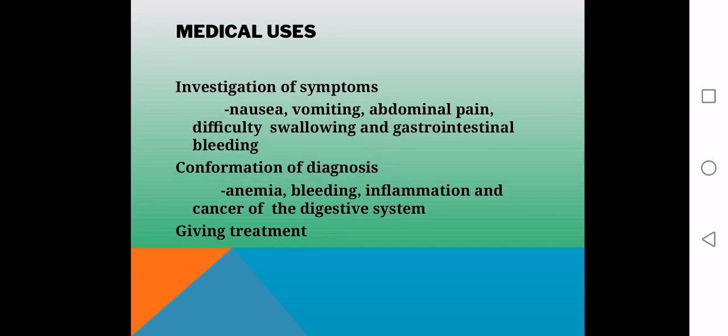Medical uses: investigation of symptoms, nausea, vomiting, abdominal pain, difficulty swallowing, and gastrointestinal bleeding. Confirmation of diagnosis like anemia, bleeding, inflammation, cancer of the digestive system.